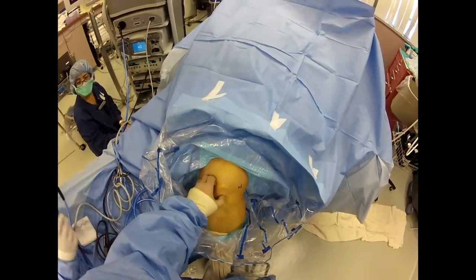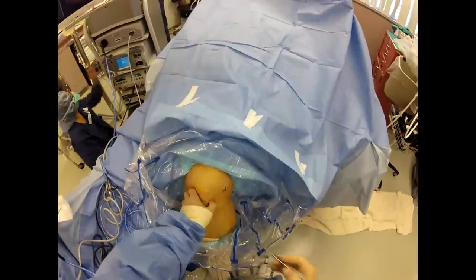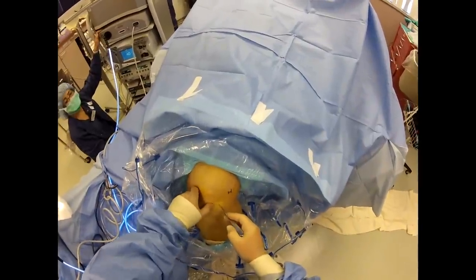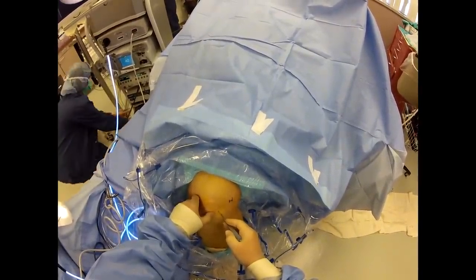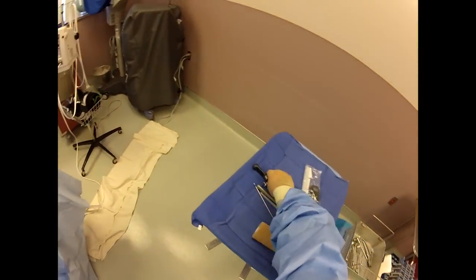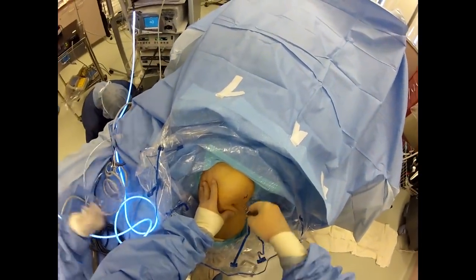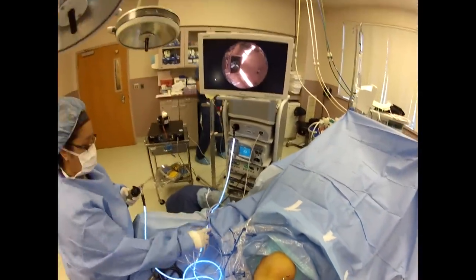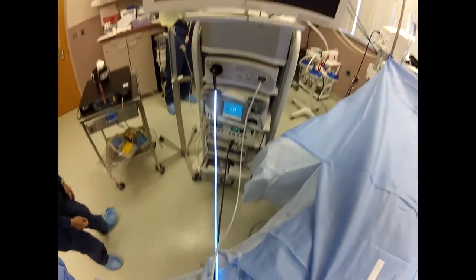You feel the inferior pole of the patella right here, and then there's a little groove right there. I make mine up a little bit past the inferior pole of the patella — the lateral portal. And then we're using the new Synergy system from Arthrax.